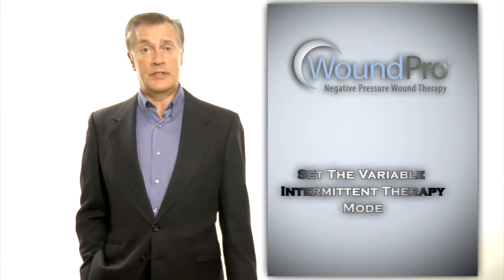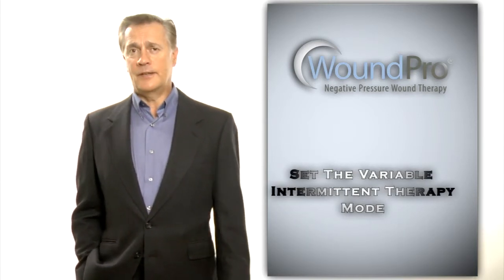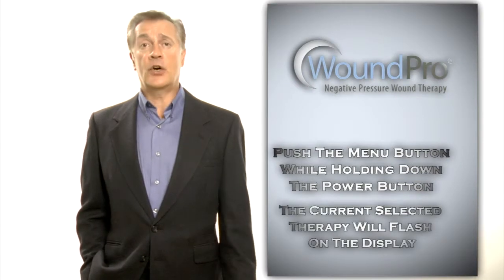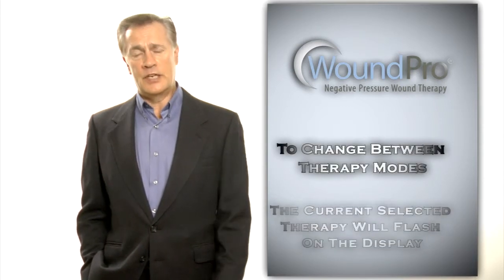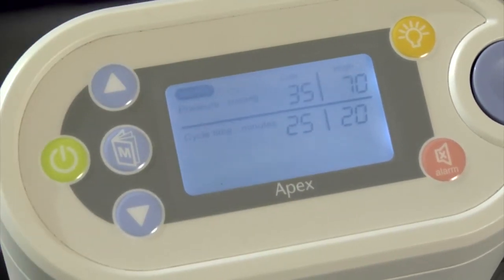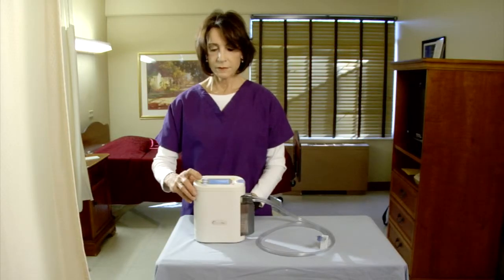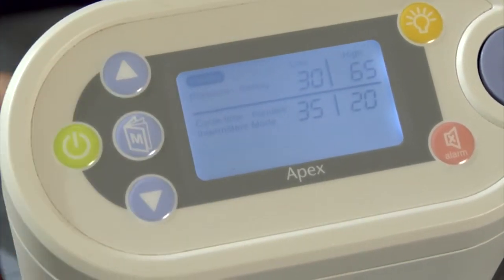Now let me show you how to set the variable intermittent therapy mode. As you will recall, to unlock the Apex, press the menu button while holding down the power button, then release both. You'll see the currently selected therapy flashing on the display. To change between continuous and variable intermittent therapy modes, press either the up arrow or down arrow keys. Let's set the Apex up to operate in variable intermittent mode. Depress one of the arrow keys until the word intermittent is flashing on the screen. Now press the menu button.